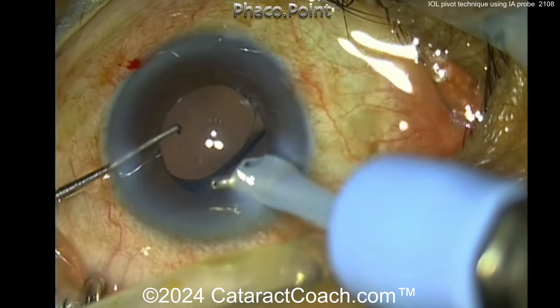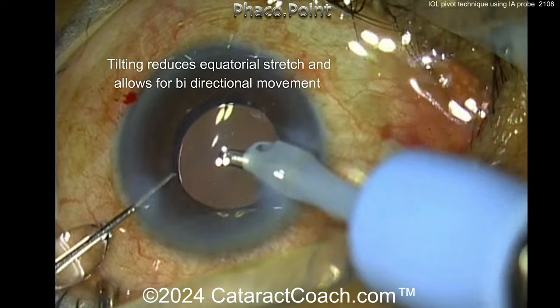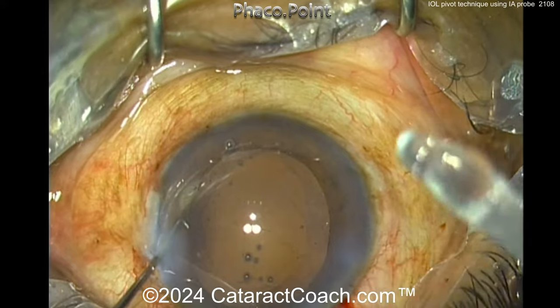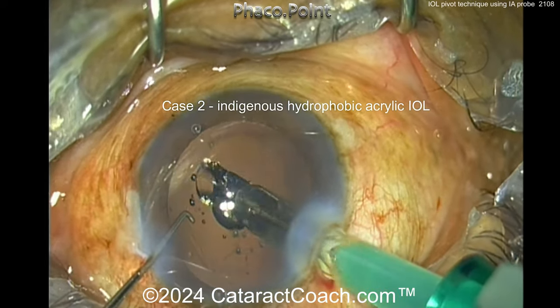We call this the pivot technique. This tilting reduces equatorial stretch and allows for bi-directional movement, so you can go clockwise and counterclockwise. Let's see another technique — another lens going in.